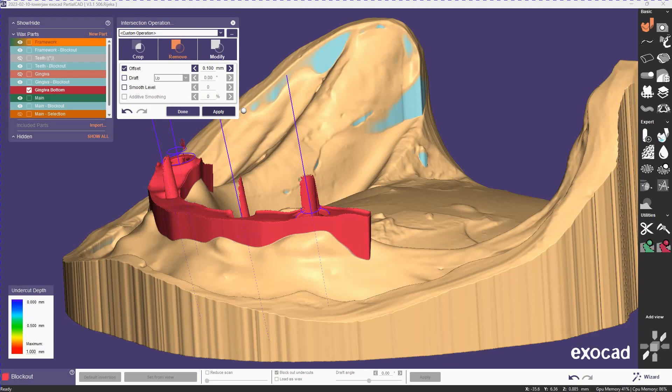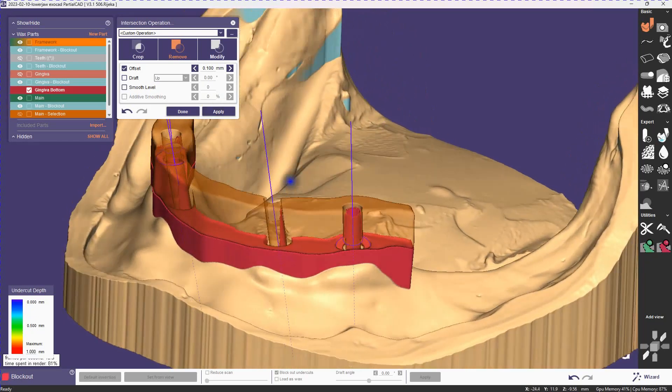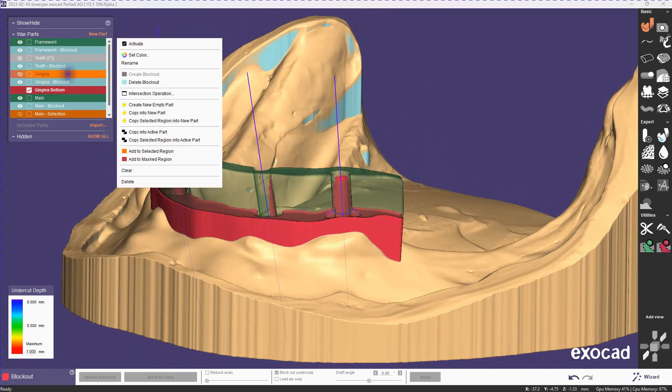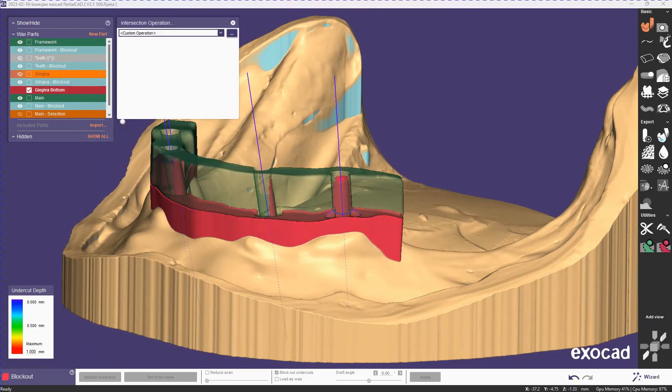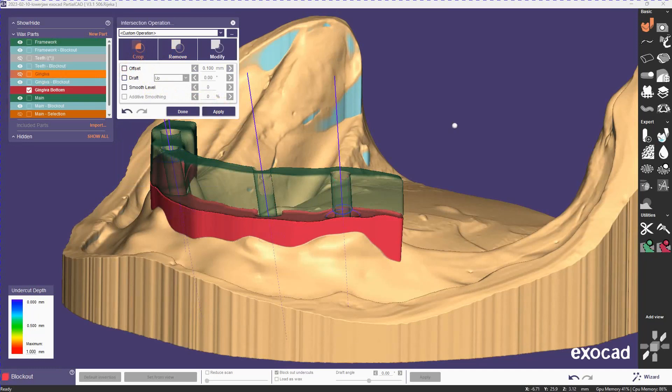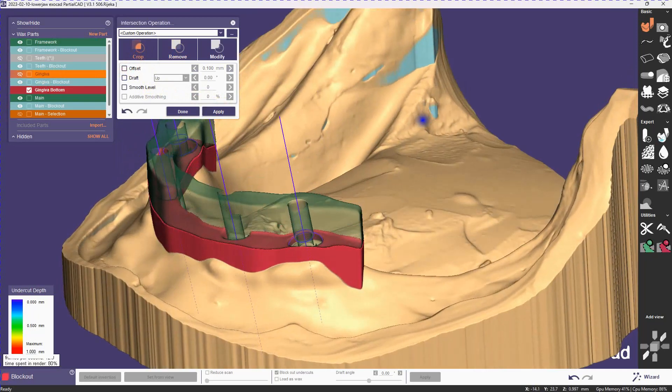Now also, you notice around the screw channels there's a little bit of noise because of the drafting. We'll just clean that up right away by doing a crop and cropping to the gingiva. So we have a good starting point now.